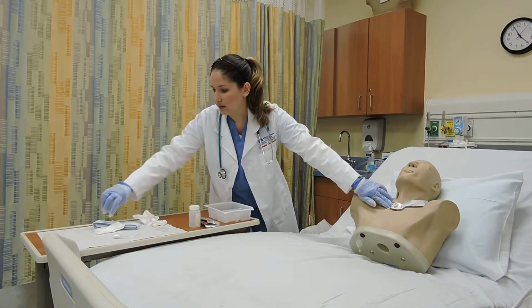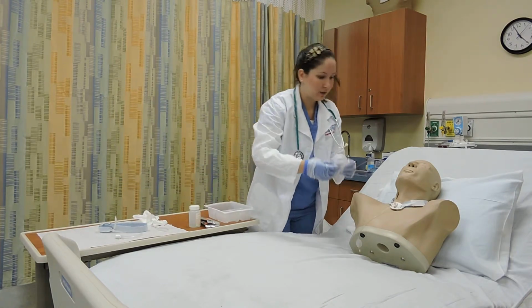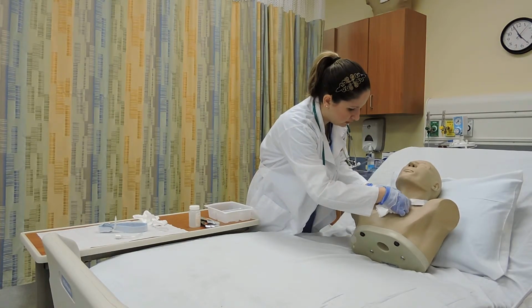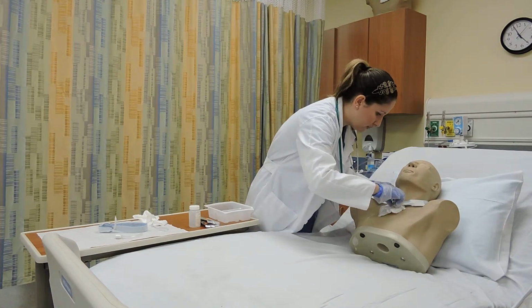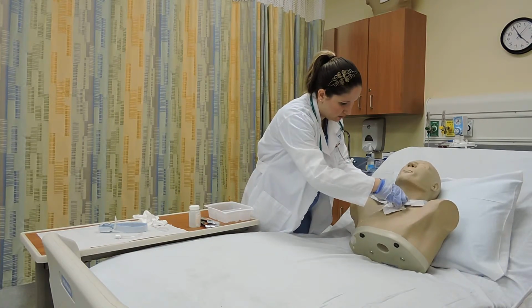We're going to replace the pre-cut 4x4 gauze with a clean one, just to keep everything nice and dry on the patient. And this would also avoid skin irritation.